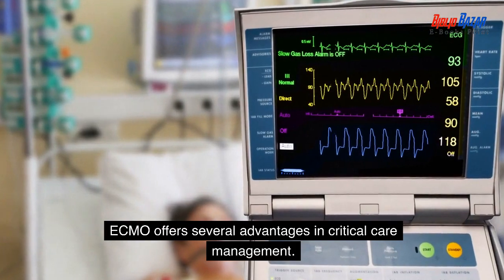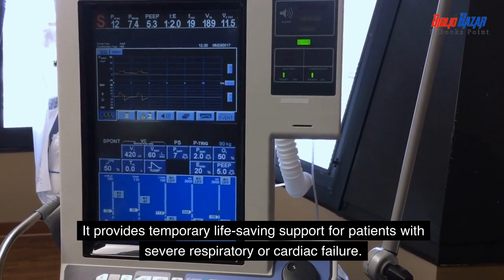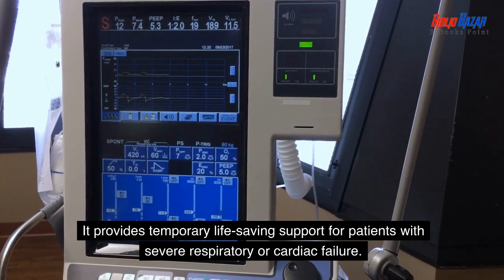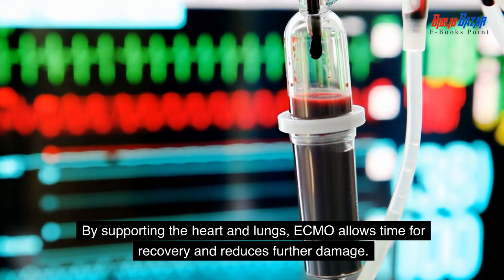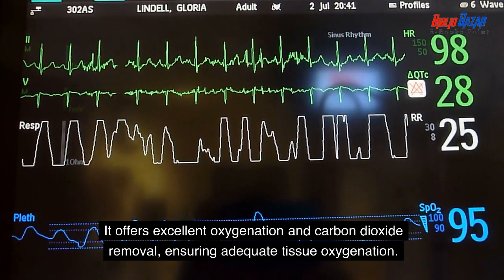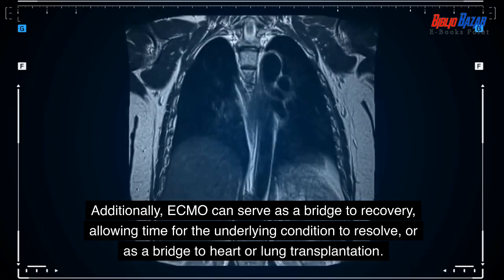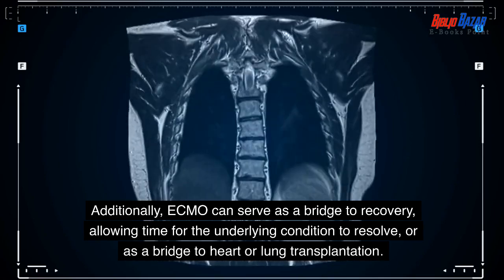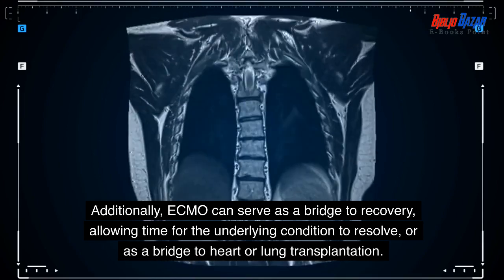ECMO offers several advantages in critical care management. It provides temporary life-saving support for patients with severe respiratory or cardiac failure. By supporting the heart and lungs, ECMO allows time for recovery and reduces further damage. It offers excellent oxygenation and carbon dioxide removal, ensuring adequate tissue oxygenation. Additionally, ECMO can serve as a bridge to recovery, allowing time for the underlying condition to resolve, or as a bridge to heart or lung transplantation.